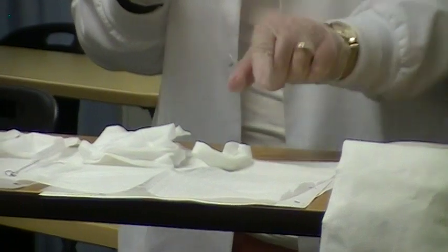So what I'm going to be doing is I'm going to pick it up, and again, I can either go to my right or to my left, go over, and place that here without crossing my sterile field. So the main concept is you can move around your table. That's why it's so important to get that table out away from everything else and where you need it to be so that you don't have to worry with it. So we have our sterile field set up.